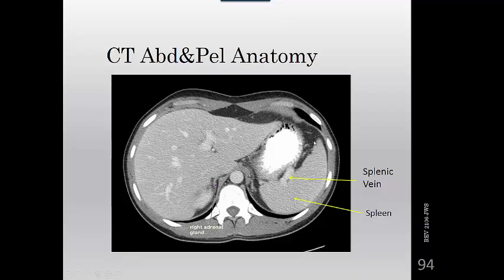This is contrast. It could be in the stomach. And this may be gastroview or barium, but you can see how bright it is and how it can streak across the pancreas, and different concentrations inside the stomach cause it to do that, and we can get artifact across the pancreas and not see it.